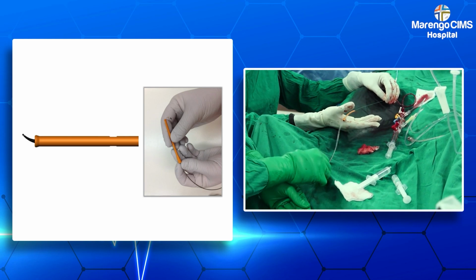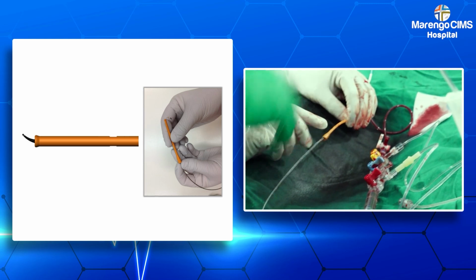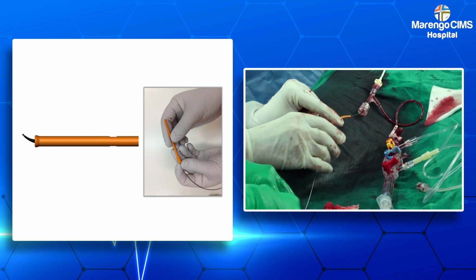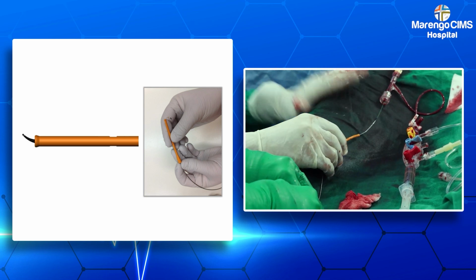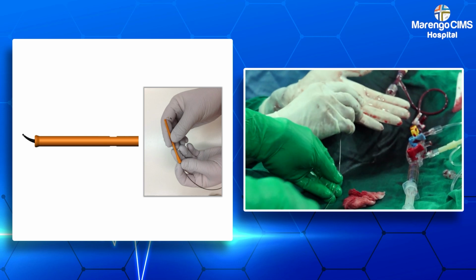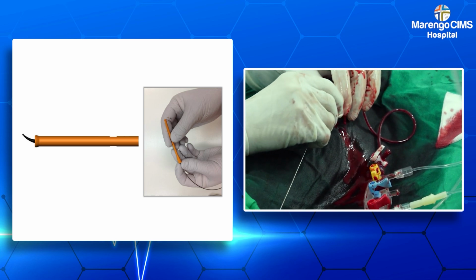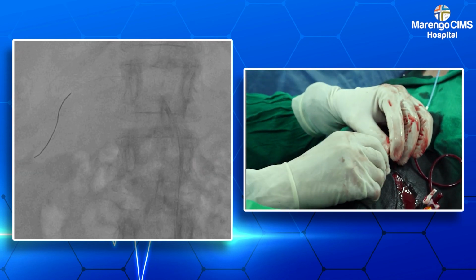So we have now the spiral catheter loaded on the Grand Slam wire. We are now pulling back the catheter straightener, electrode straightener, whatever you call it. And you can see a straightened spiral catheter, slightly angulated where the electrodes end, a slight 5-10 degree angle, gentle curve, and we are now entering the right renal selective artery.